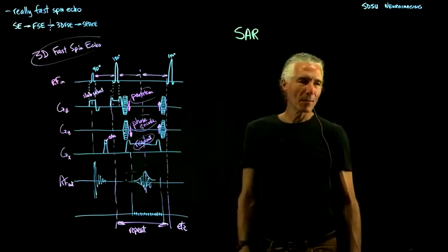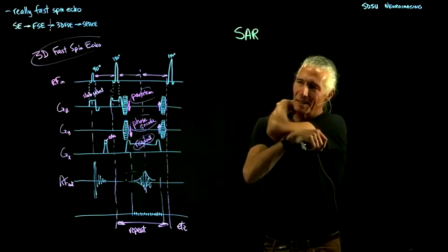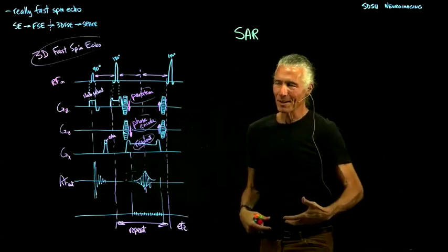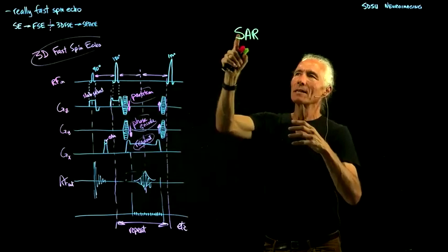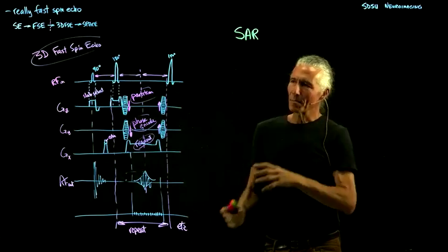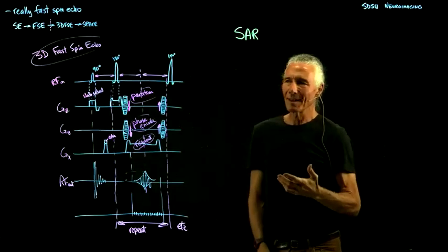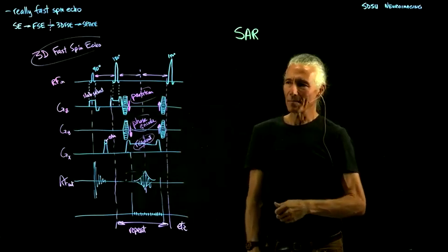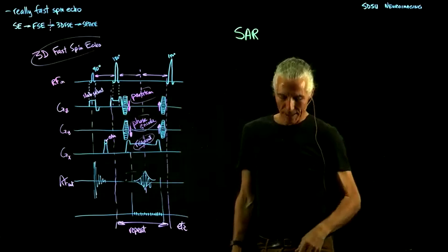But not all the RF power gets absorbed, because you're not a very good antenna. You don't have a lot of metal in you, and if you stick some metal in the microwave, more energy gets into it. So we're not a very good antenna, and most of the RF is still sloshing around. RF are radio waves that can propagate through a vacuum. So you measure how much RF was left after we ran the RF pulse, and you can tell from that how much went into the body. You carefully measure that all the time to make sure it doesn't get too high.